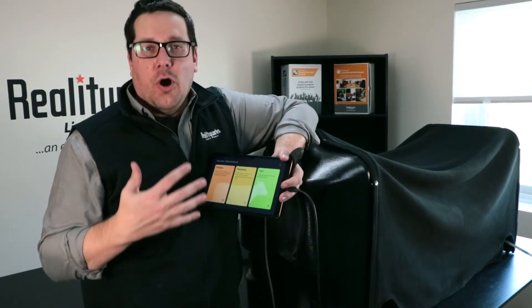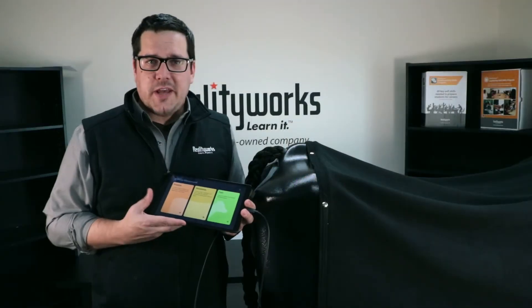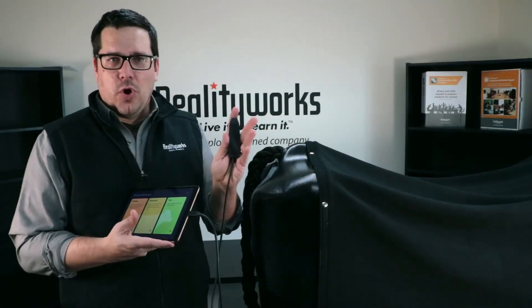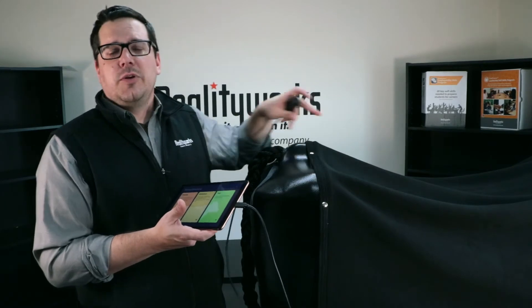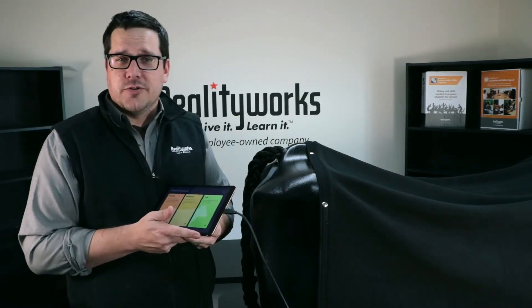We're going to talk about the ultrasound side of the bovine birthing and ultrasound simulator. It comes with a tablet and also has a probe. Inside there are sensors allowing you to go inside, probe, and show different features of ultrasound.